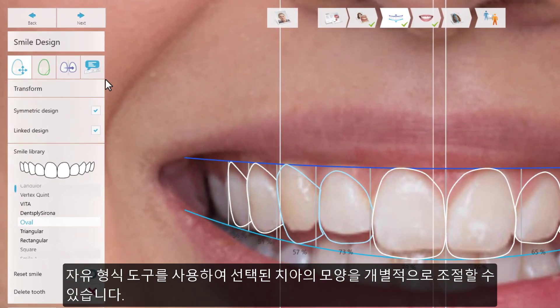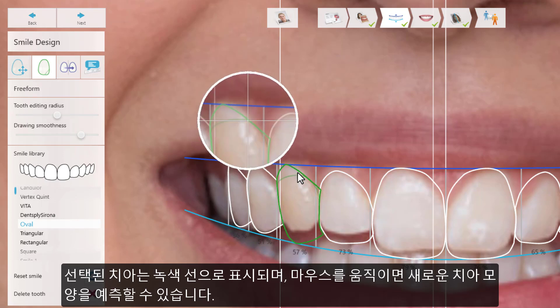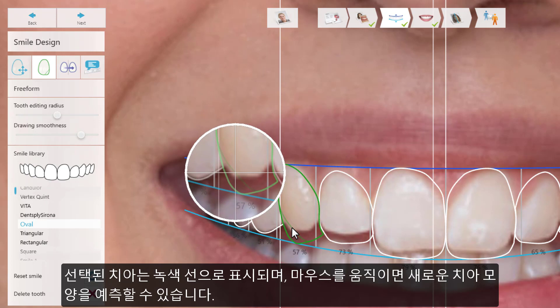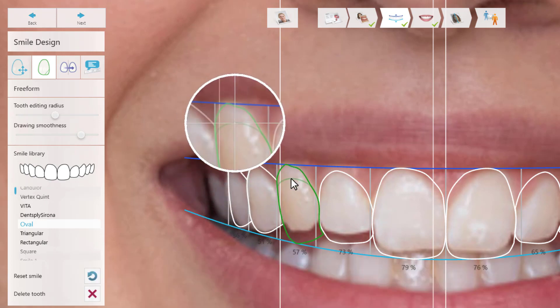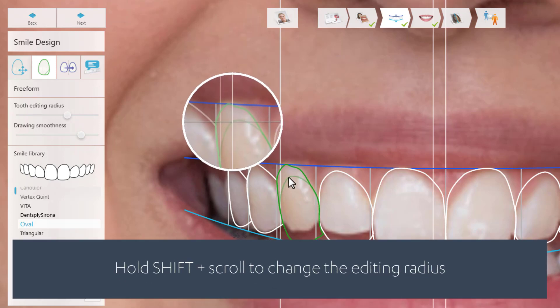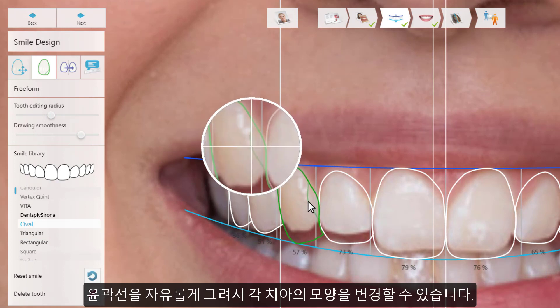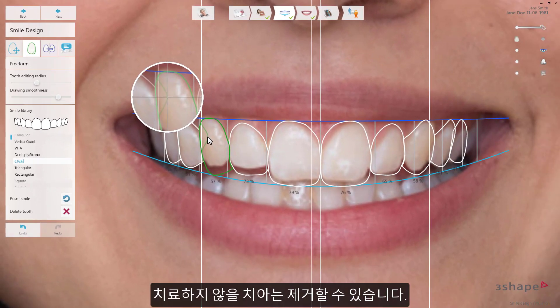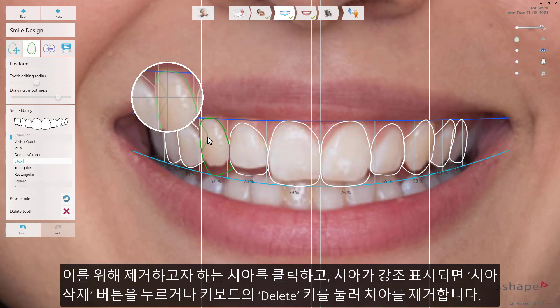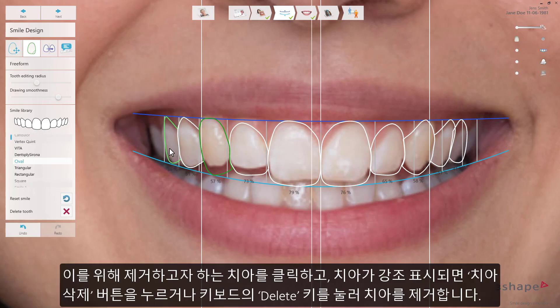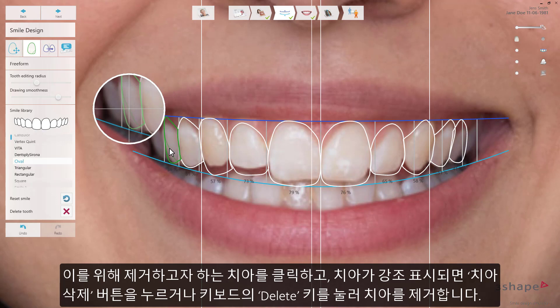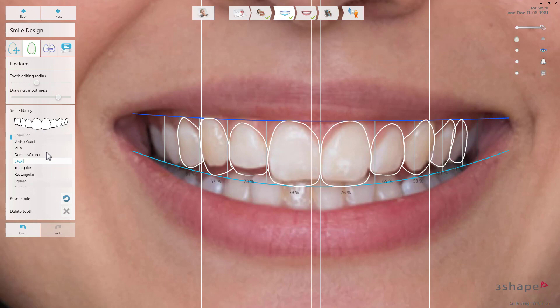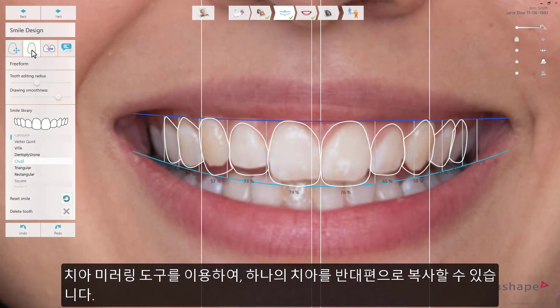For your selected smile frame, you can use the Freeform tool to change each tooth's shape. Hover over the selected tooth, indicated by the green coloured border, to see a prediction of the new shape. You can also change the shape of each tooth by freely drawing its outlines. You can remove any tooth from the smile frame if you don't wish to provide treatment for it — press on the tooth you want to remove, and when it is highlighted, remove it using the delete tooth button or just delete on your keyboard. With the aid of the mirror tooth tool, you can copy the design from one tooth to the contralateral one.